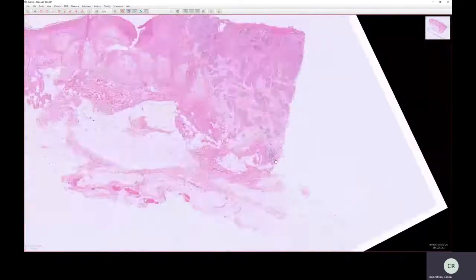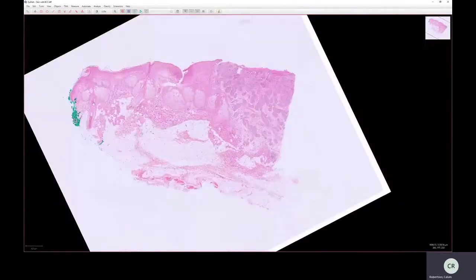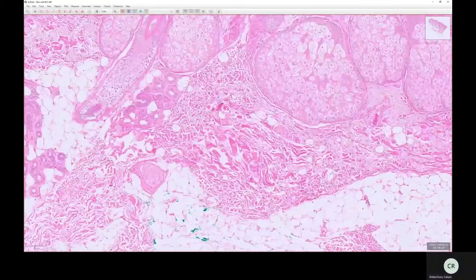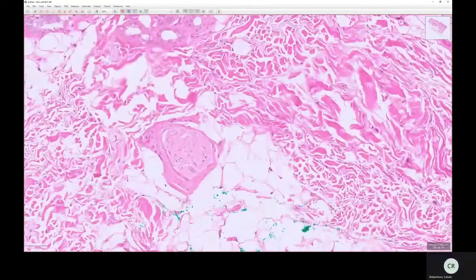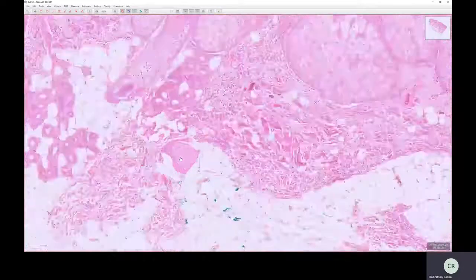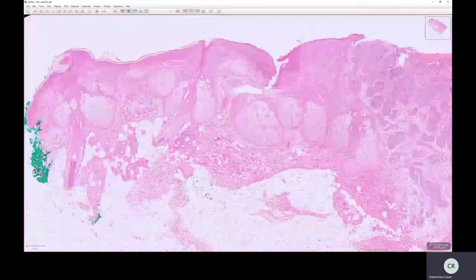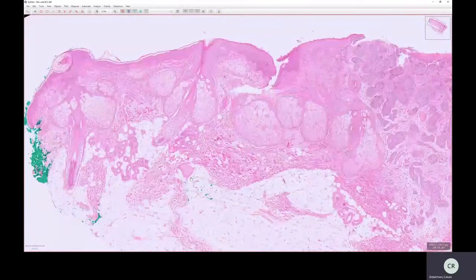But this is a 2D section through a 3D structure, so it's always useful to keep that in mind when you're looking at anything really. Here, for example, we've got a nerve out on its own. There probably is a vein and an artery associated with this, but we're just not seeing it in this plane of section. Okay, we've pretty much covered most of it now.